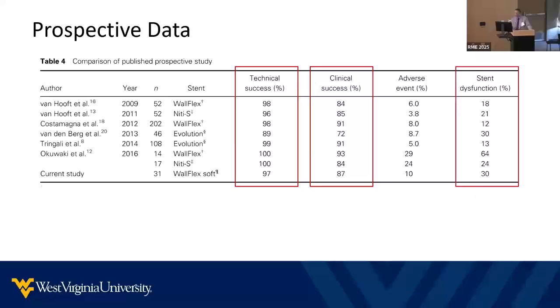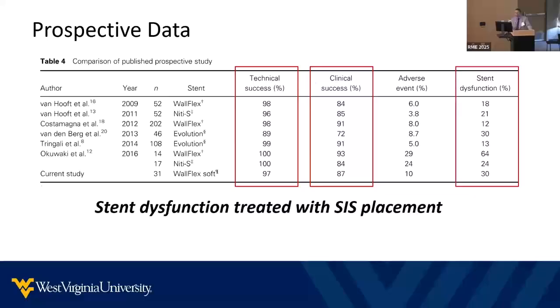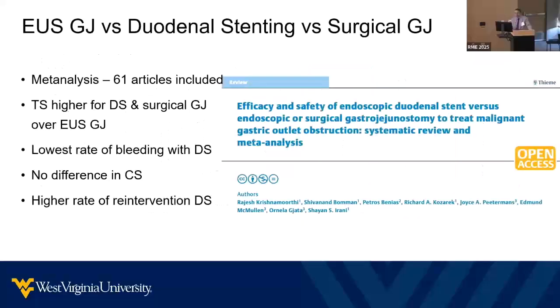Yes, there's some evidence of stent dysfunction, but in the majority of these studies, they were all managed with stent placement, and there was no difference in survival. Over 75% of the cases were managed with stent placement.